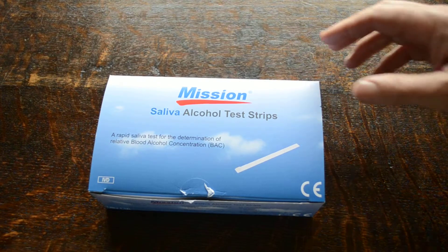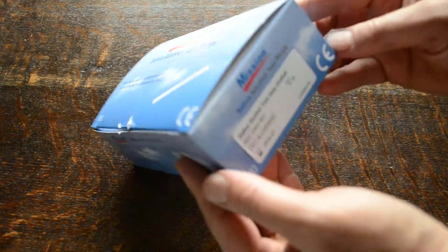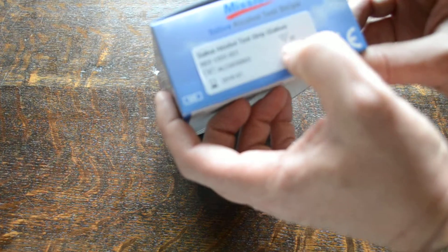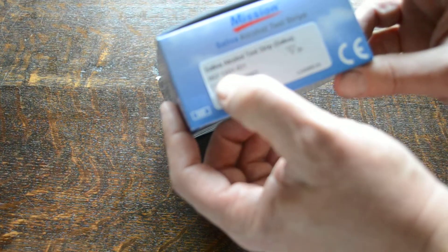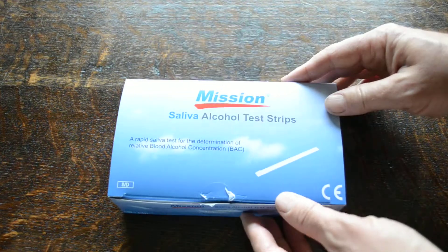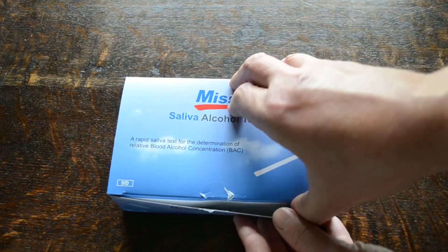They come in packs of 25 — this is the standard pack shown here. Saliva Alcohol Test Strips, 25 test pack. Catalog reference CO31021. They have expiry dates of around 18 months at time of purchase and manufacture.